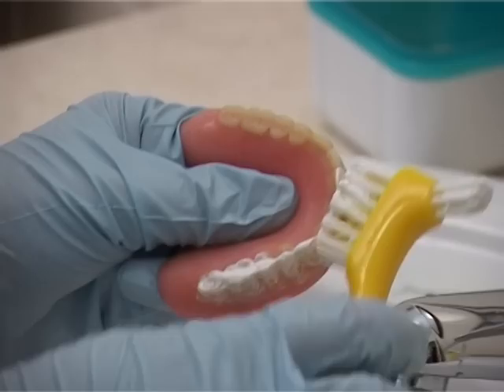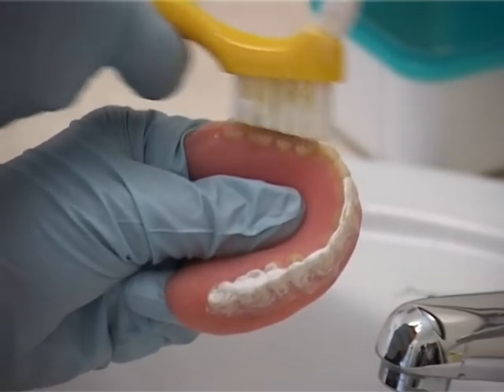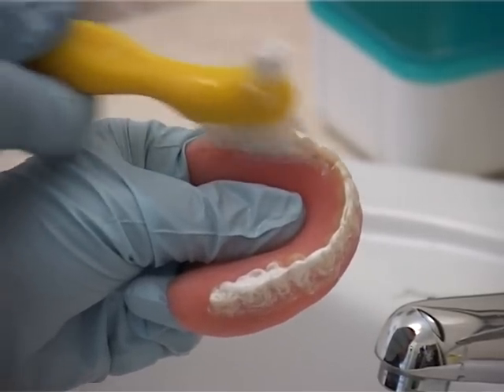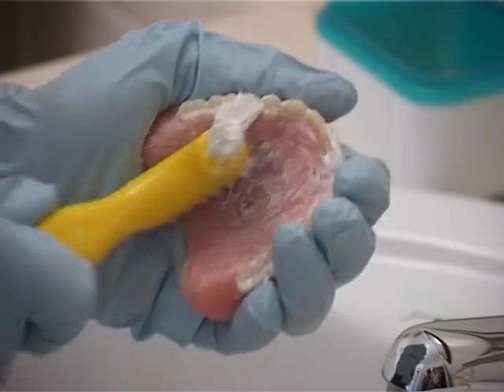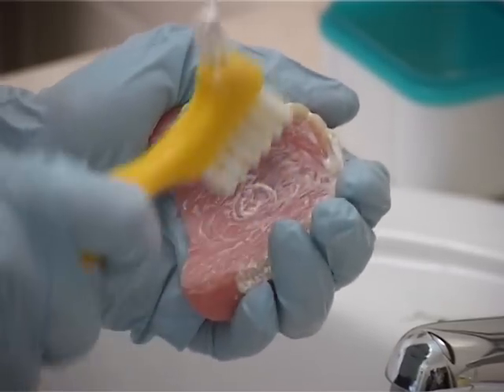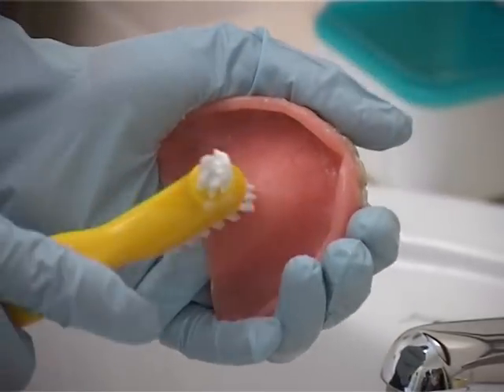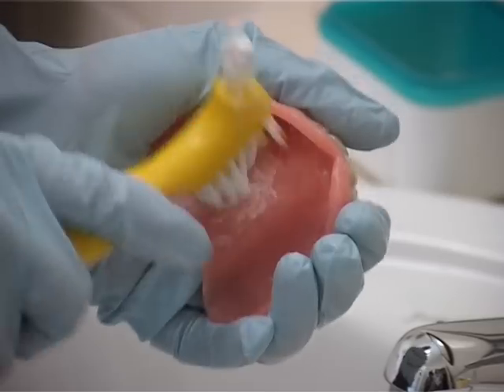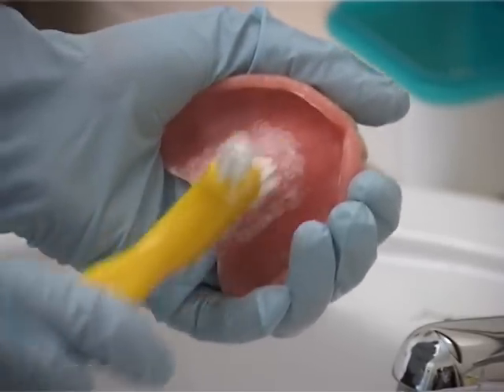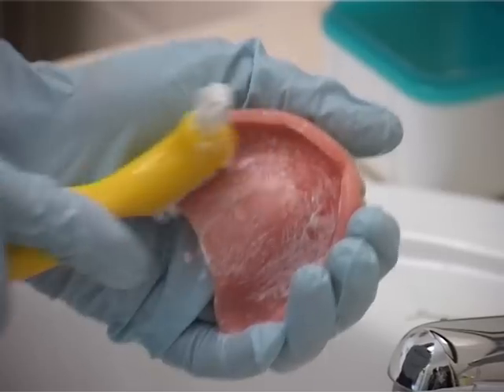Then you can use a denture brush to clean the teeth. Carefully support the denture in the palm of your hand to clean the inside surfaces. Use denture cleaning paste rather than toothpaste, as toothpaste can be too abrasive for dentures.